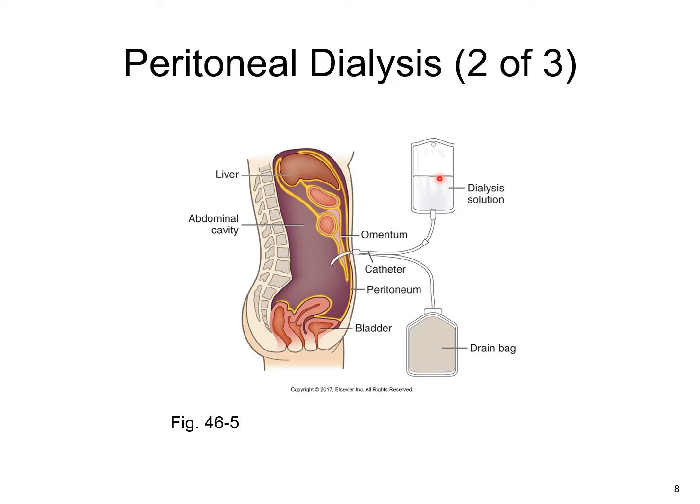So remember, everything is happening in the peritoneal cavity. You don't want your dialysis solution to be too cold. Ideally, you want to have taken it out from wherever they keep it. Make sure it's at least at room temperature. You don't want it to be too cold because it can actually cause contraction. If there's contraction, the exchange that needs to happen in the peritoneum is not going to be as efficient as you would like it to be, right?